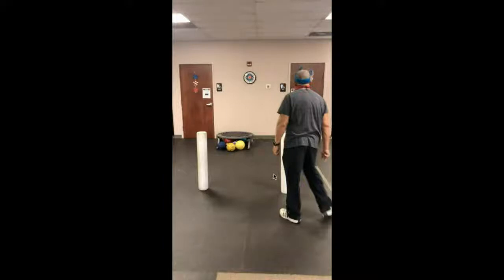But there are differences that we can understand with putting the visual feedback on that allow us to tie into where they're having their biggest changes. So oftentimes this is done in a clinic where you have just targets on the ground, or sometimes you put up chairs. I prefer chairs or a larger target. These are foam rollers that I use in my clinic because it allows them to also integrate the peripheral vision or the dorsal stream vision for at least recognizing in space where they are compared to other objects.